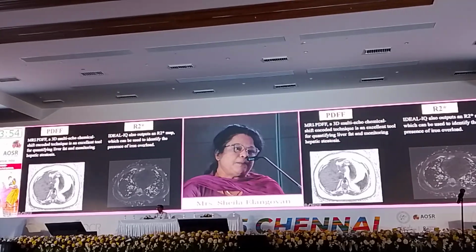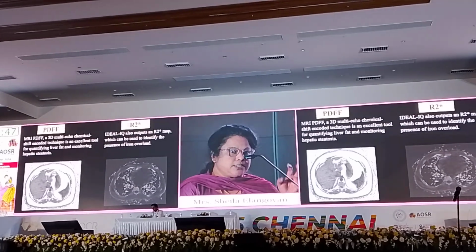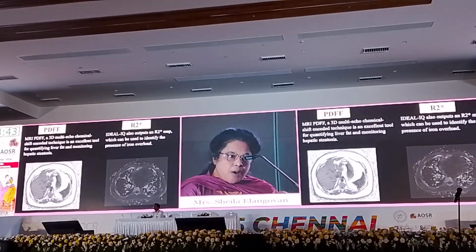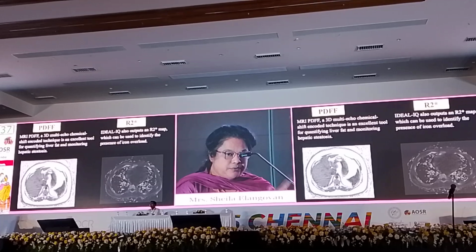So what do you mean by proton density fat fraction? So it's a fraction, right? You have a numerator, you have a denominator. So the numerator is the signals from the mobile protons in fat. The denominator is the sum of the mobile protons in fat and water. So this is the fat fraction that we are going to quantify.